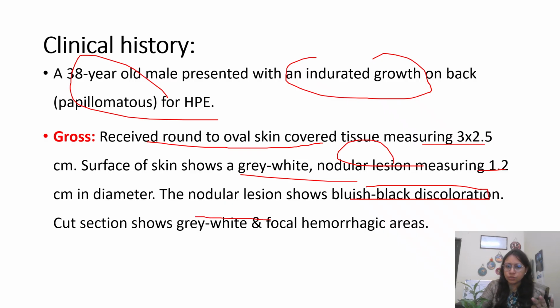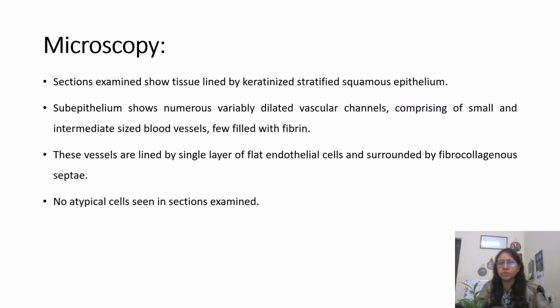Cut section showed grey white and focal hemorrhagic areas. So this was the gross picture of the swelling present on the back of the patient.